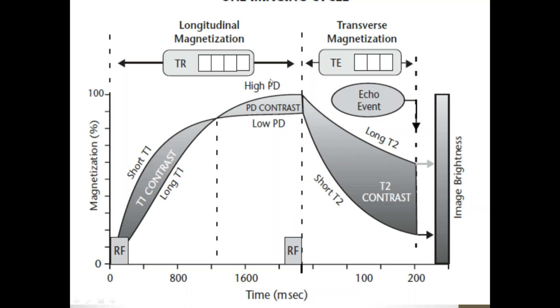So how can I, as a machine, differentiate between all these signals coming out? You are detecting all the signal, but you depend on the difference in signals, not on the signal itself.